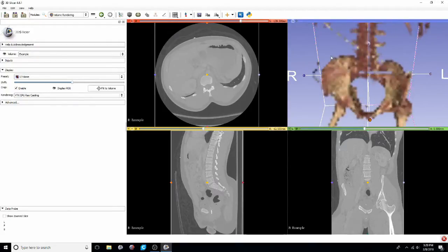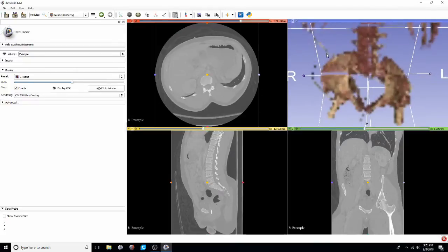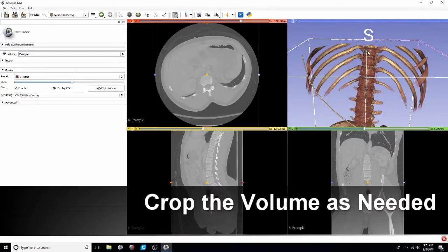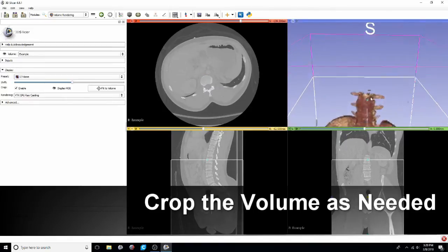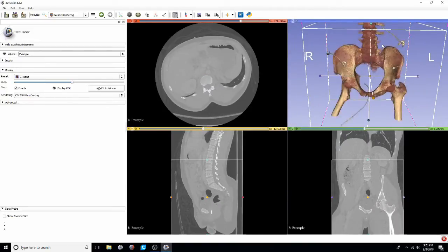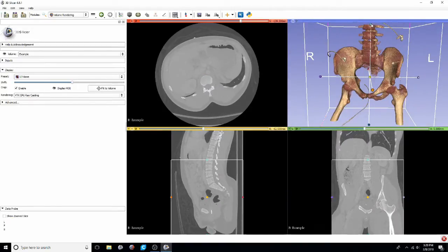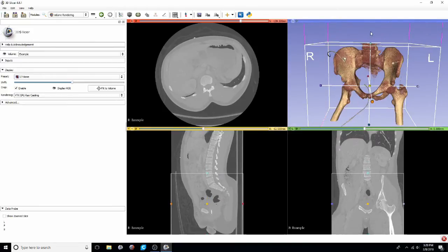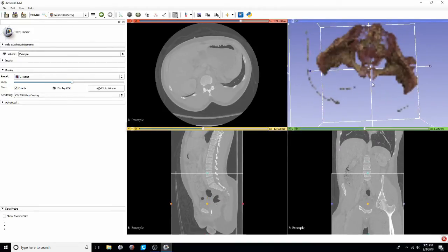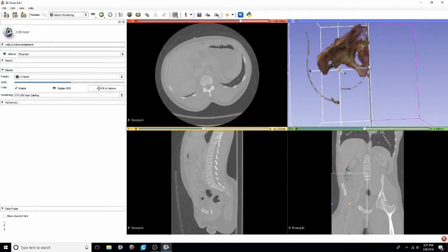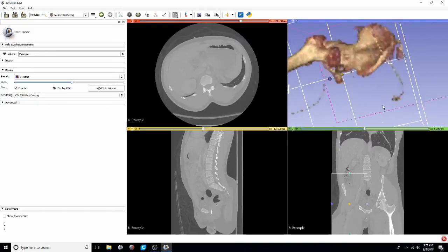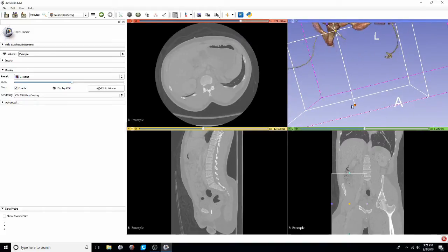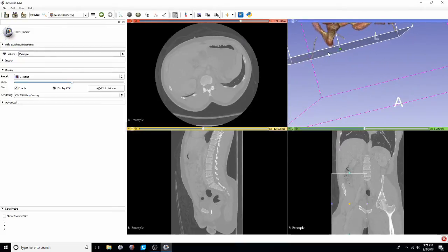This visualization won't ultimately affect our segmentation but it really allows us to better crop the volume and to kind of see generally what we're working with. I'm just using the mouse to pan, zoom, and rotate around the model. Just trying to crop that volume down to the smallest one possible that still for sure includes all of the anatomy that we want to segment.